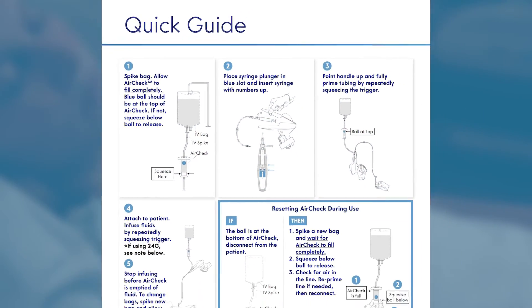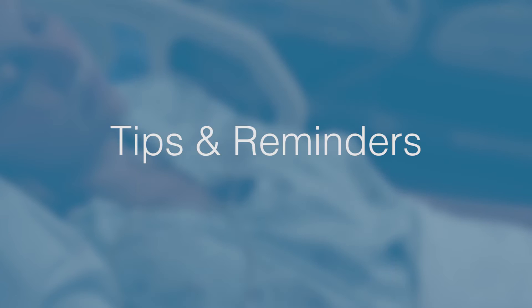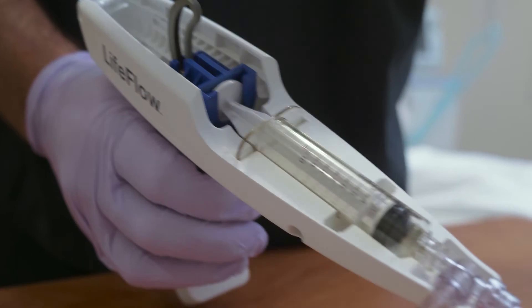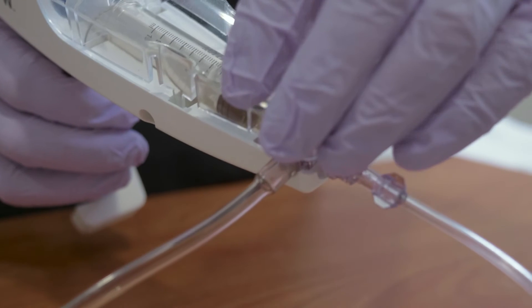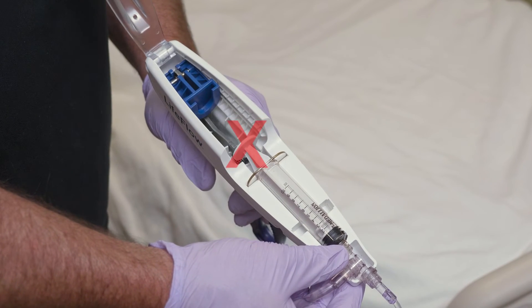Note that the quick start guide in the LifeFlow bag contains step-by-step instructions on the setup and priming of the device. When loading the syringe, make sure to seat the syringe in the blue shuttle. If not seated correctly, the shuttle will not engage the syringe.